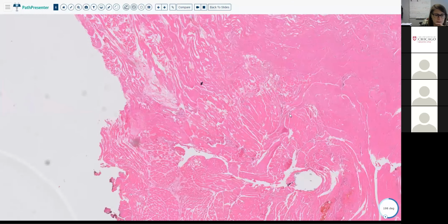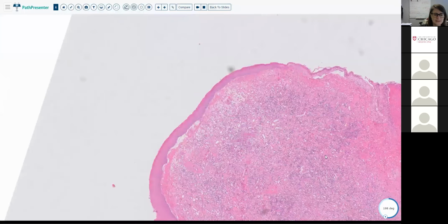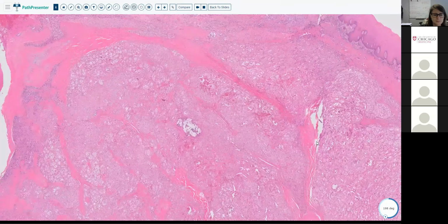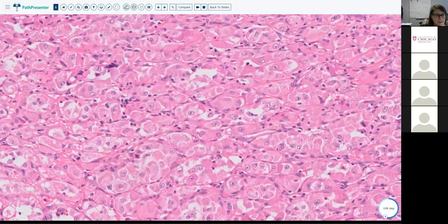Certainly, because we're in a soft tissue lecture, it's going to be a soft tissue tumor, but you always want to think of your differential of things that could arise in mucosal sites. And we didn't see any overlying dysplasia. It's quite deep, and it has a very nested, solid appearance. Very, very prominent nucleoli, very nested, very granular.